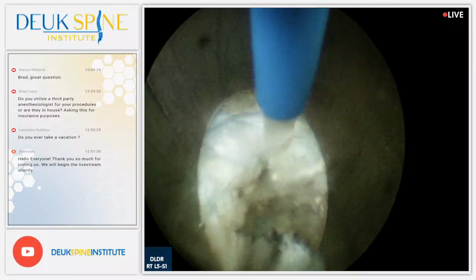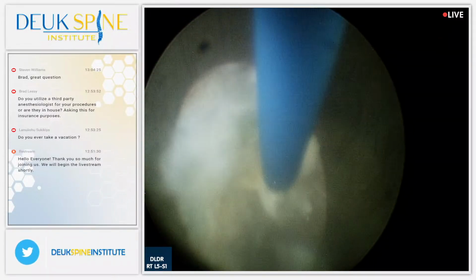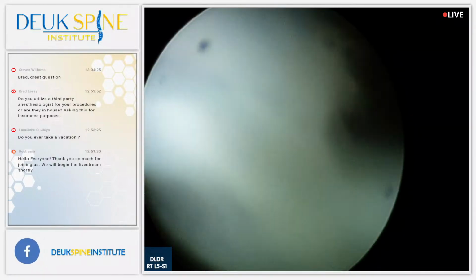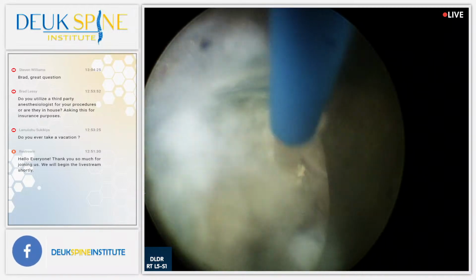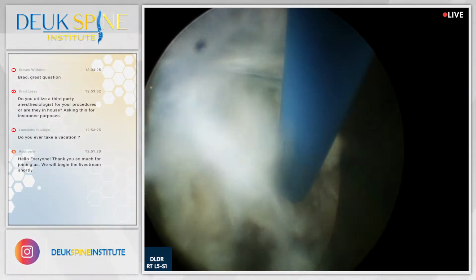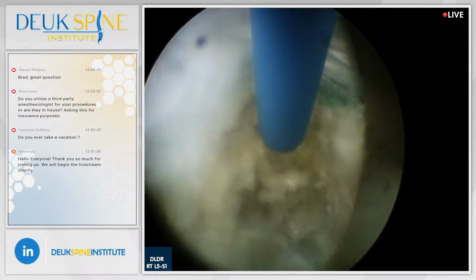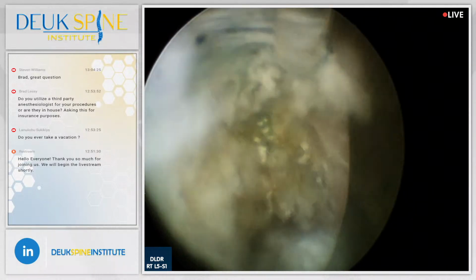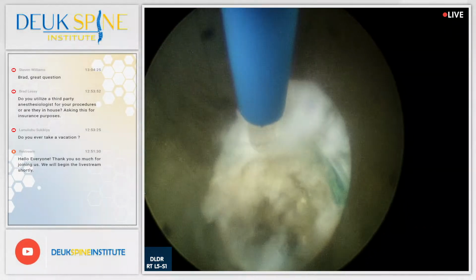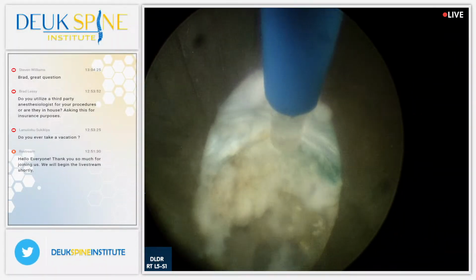We're just about done with this disc, but before we finish, I want to take some questions, and then we'll finish off by showing you how we fix facet joint pain, the second most common cause of chronic back pain. How we fix it here at Deuk Spine, how the rest of the world should be fixing it if they were doing it right. It's not an RFA. RFAs do not provide permanent relief of pain. It's temporary. But we now have a permanent fix to facet pain. And we'll be done with this disc repair in about 5 minutes.